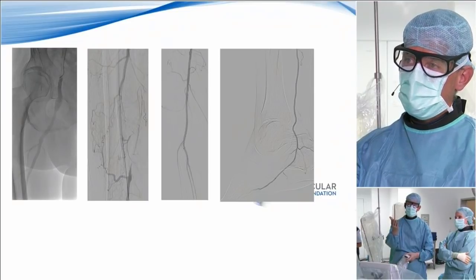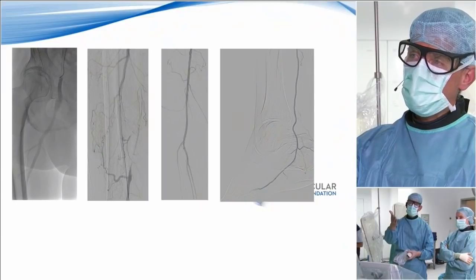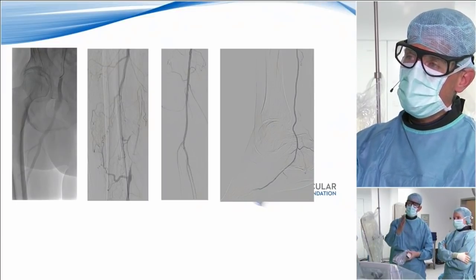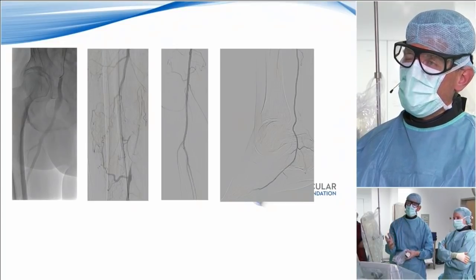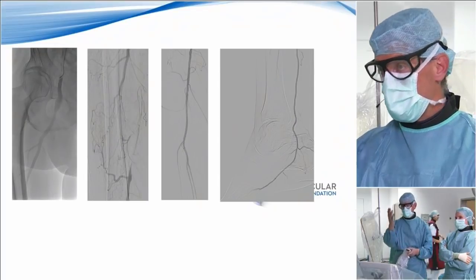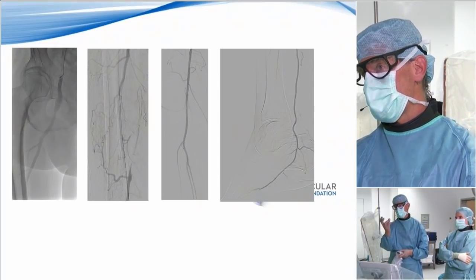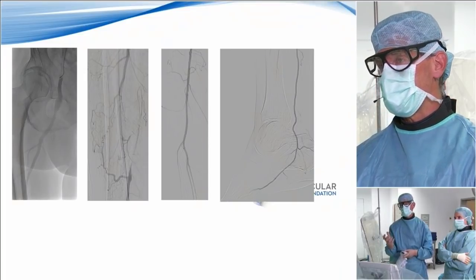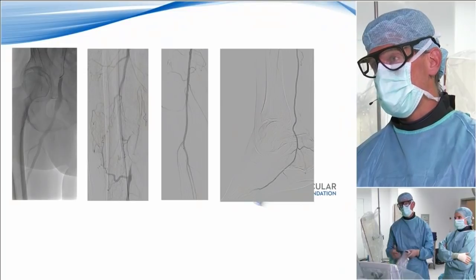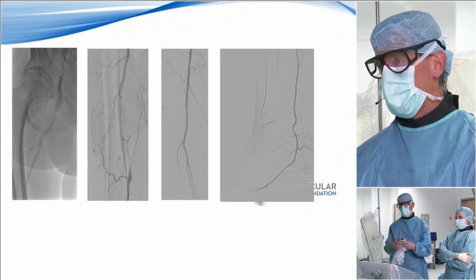If you cannot access from antegrade, you cannot. I mean, you could puncture out of the common femoral artery, but then your covered stent would maybe protrude over the profunda origin. Maybe a little bit risky for the profunda. Coming from retrograde could also be risky, but usually after surgery the profunda is very big, so we haven't seen any compromise of the profunda with our technique. With PQ bypass, not sure. Maybe a risk, but maybe not. Could be an alternative, clearly.